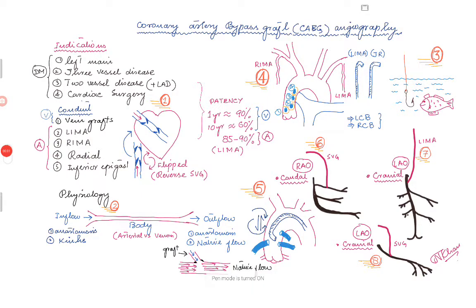Everybody, today we are going to talk about coronary artery bypass graft angiography. Some of you asked me to cover this topic, so we're going to be talking about the most practical things related to CABG as well as angiography.